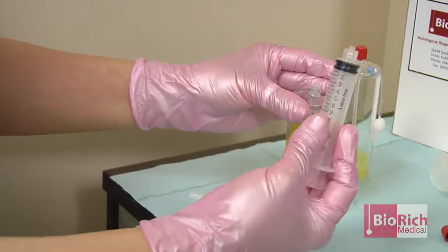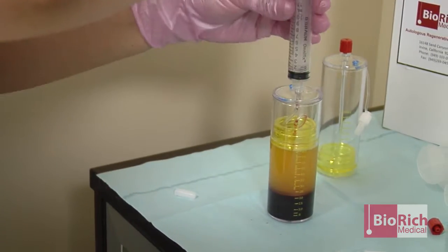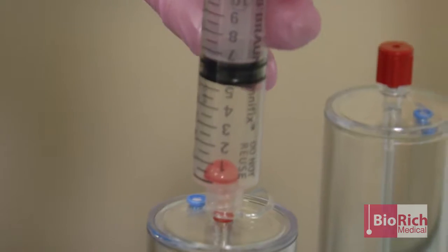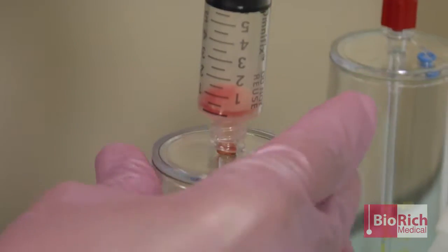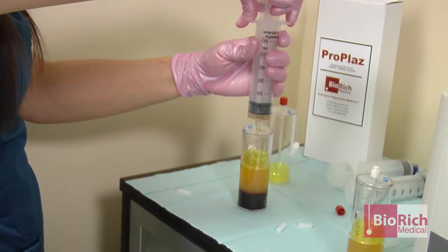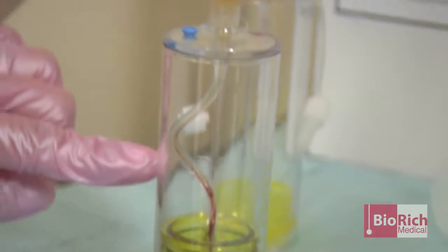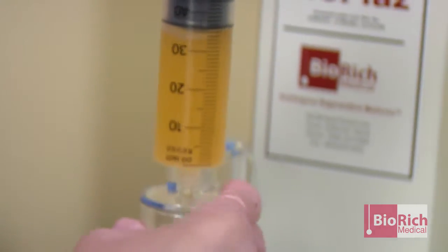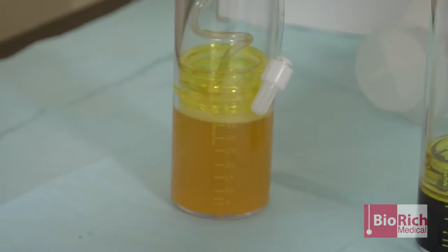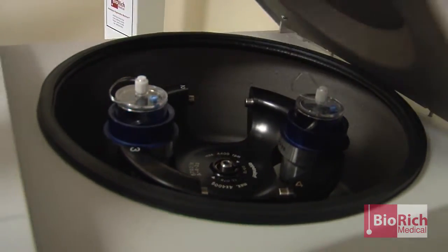The second tube will do the same process. You grab the 10 cc syringe to remove any of the extra RBCs stuck in the tube to keep the PRP pure. Slowly pull without getting any of the RBCs. As soon as I get to the bottom, I'm slowing down because I don't want to get any of the red blood cells into the pure PRP. Then we fill the second chamber.